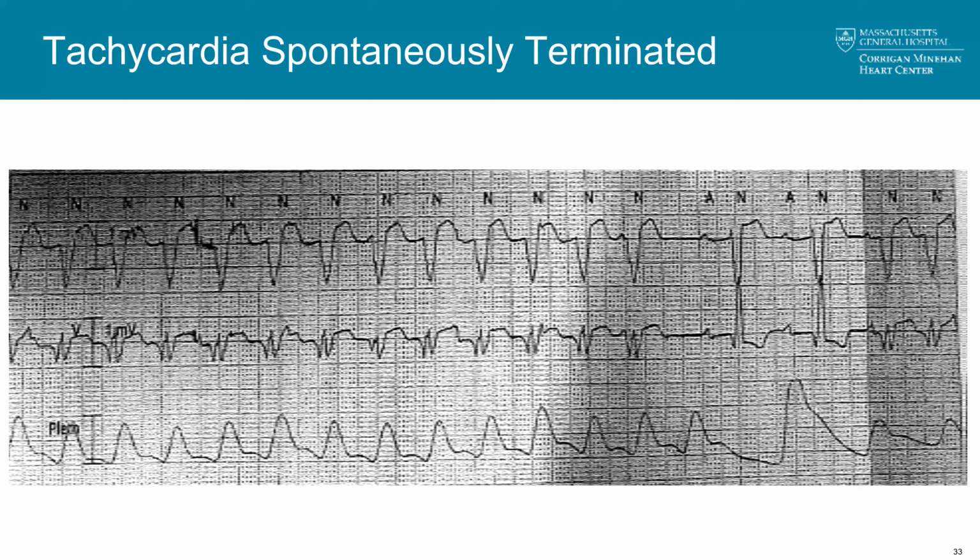Everybody's clinical circumstances are going to be different. And if you're in control of the EKG machine and you could do it by yourself very quickly, then absolutely do it. But if you're in a setting like mine where you have less control over how these things are done, it may be one additional step that distracts you from how the patient is doing. So you'll have to decide whether or not change in paper speed helps you out. It's certainly a good possibility. It's not something I routinely do just because where I work, it would be, number one, difficult for me to do, and number two, may distract me.